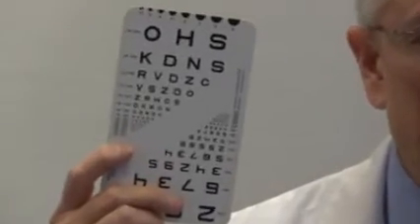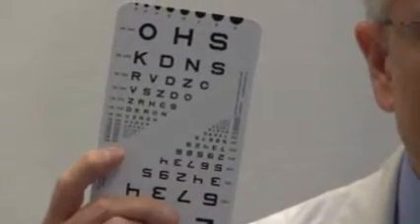The lines change size in 0.1 log unit steps, so the line above a given line is 1.26 times larger than the line below. What this means is that you can use this card at any distance when you're using M notation. The letters are roughly equal in legibility.